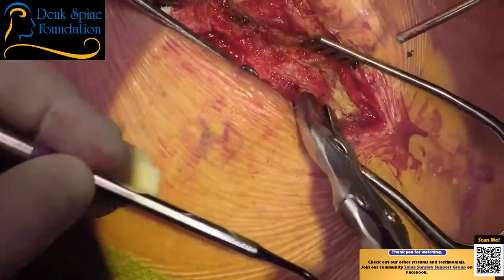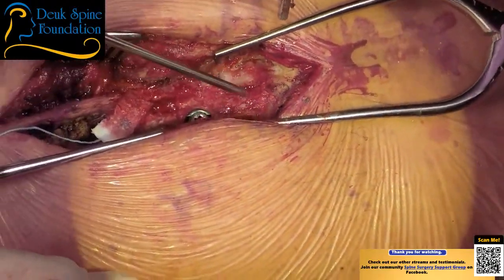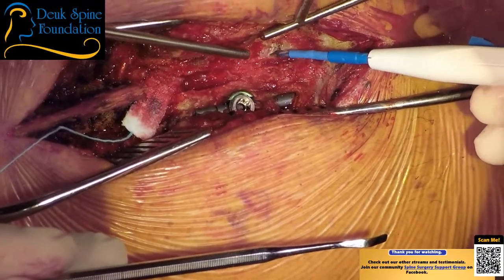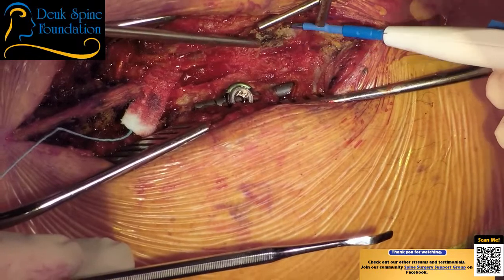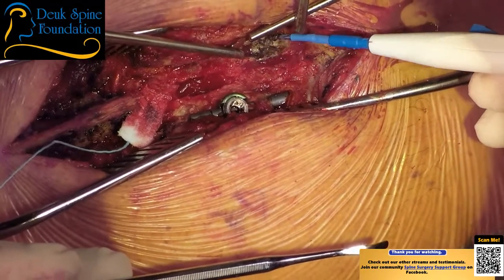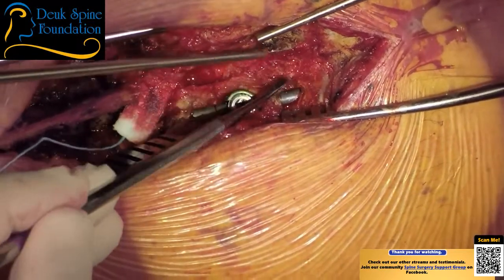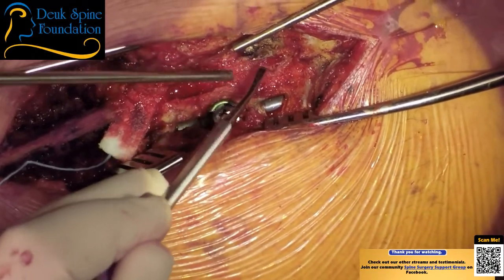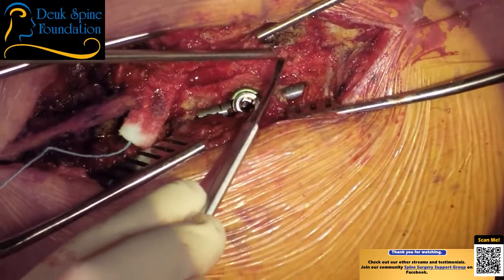Remember, these open surgeries that we do, like the one you had before, they do create scar tissue. So it's best to avoid them. In his case, he couldn't, but there are so many fusions being done nowadays. The surgery that I did before created this little bit of scar tissue. It looks like a lot, but it's not a lot of scar tissue. That surgery was very delicate, but still you can see scar tissue is made. It's still created.